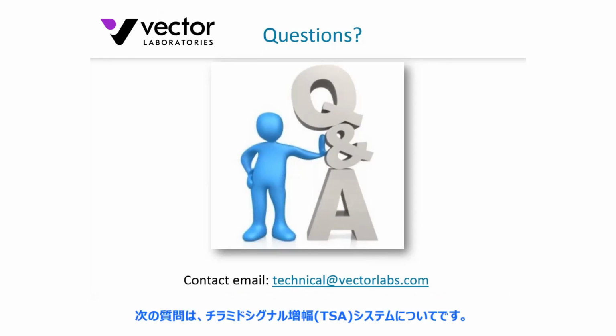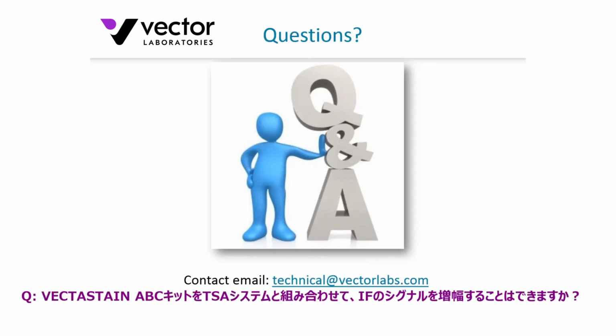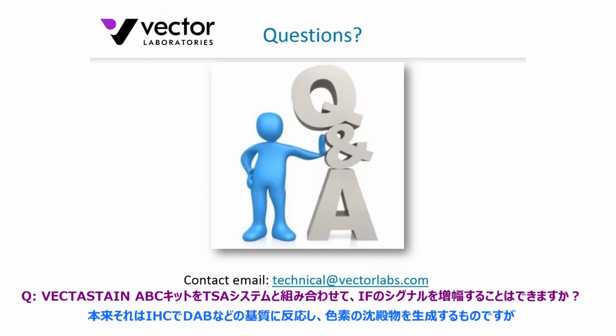Okay, the next question is about tyramide signal amplification. Can I combine the VECTASTAIN ABC kit with the TSA system to amplify my IF signal? Oh, absolutely. The VECTASTAIN ABC kit works on the principle that it has a lot of horseradish peroxidase in it.